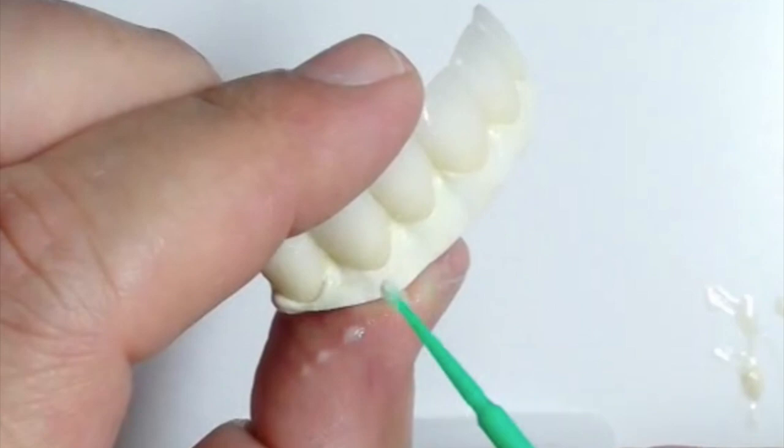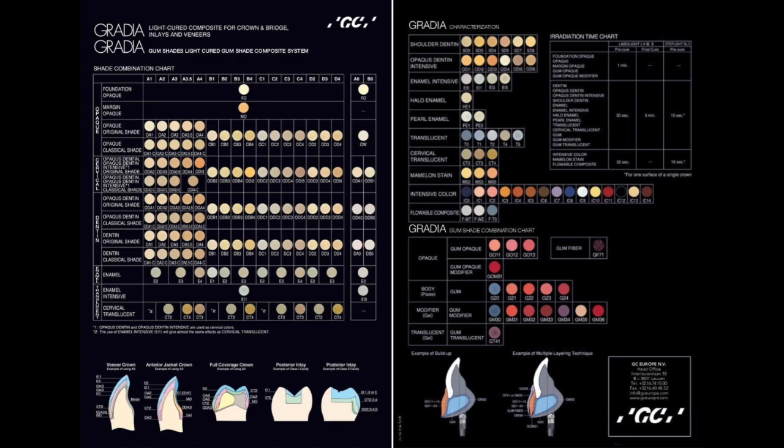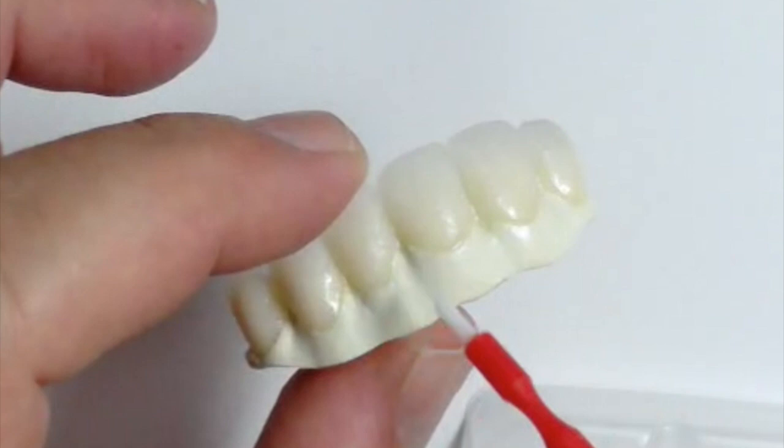Clean off the excess cement that came through once you place the crowns. Make sure it's nice and clean — you don't want it all over the Trilor. Either way, you'll be sandblasting the Trilor after cementation. Clean it up before it gets hard. Now for the composite work with the Gradia system — it comes with everything you need. Since we're only putting pink on the Trilor, we focus on the opaques, modifiers, gum opaque, and translucent composites. Once we have the framework sandblasted, we add the composite primer to the section we're adding composite to.